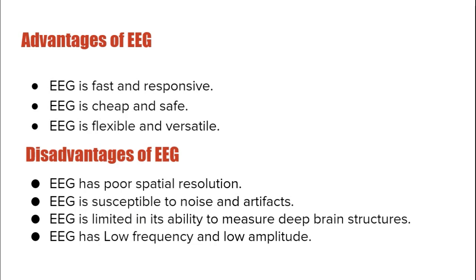So, I will talk about some advantages of EEG. EEG is fast and responsive. EEG is cheap and safe, and EEG is flexible and versatile. The machines of EEG are not that expensive, so it is cheap and it is safe to get an EEG.